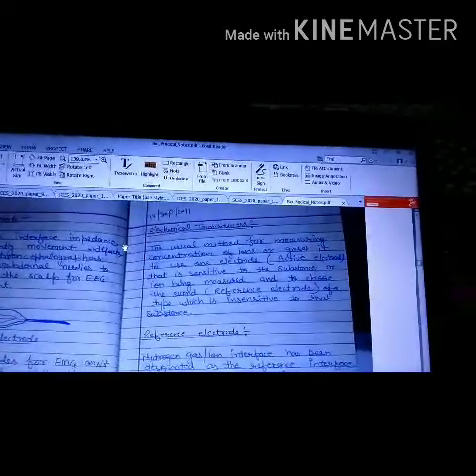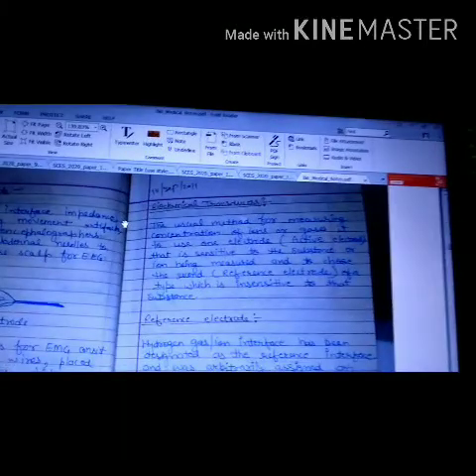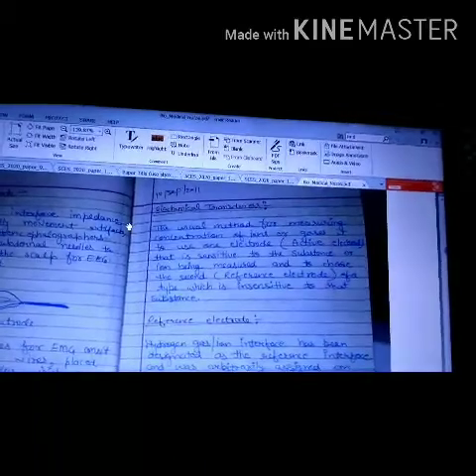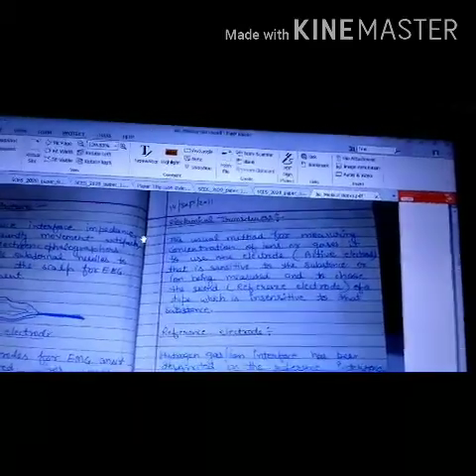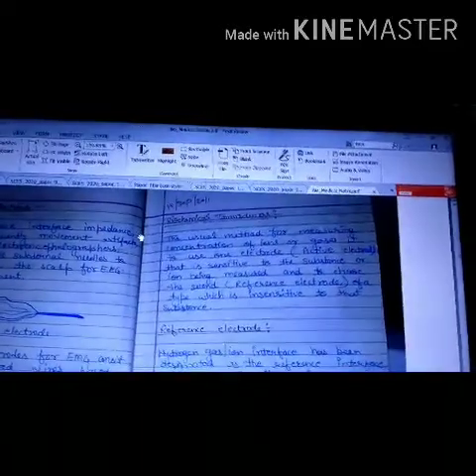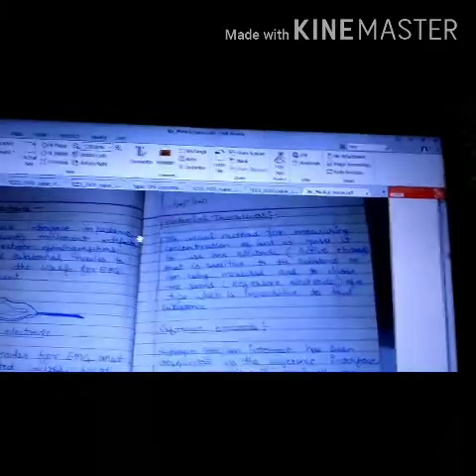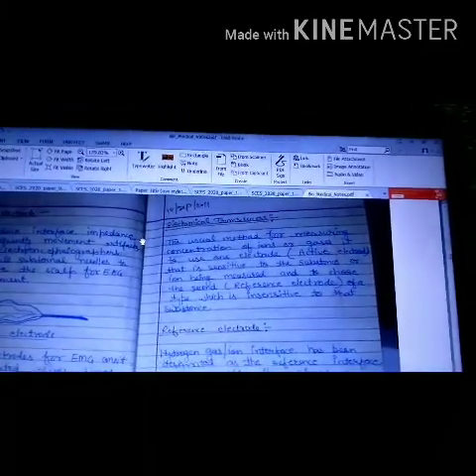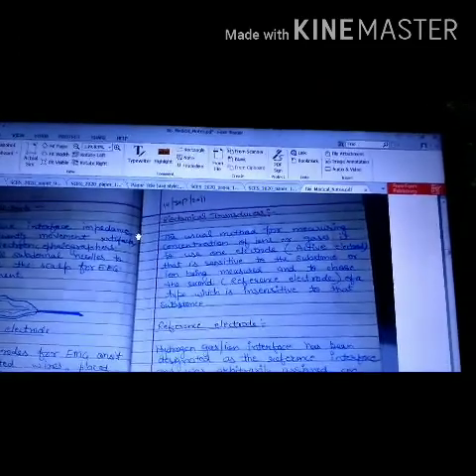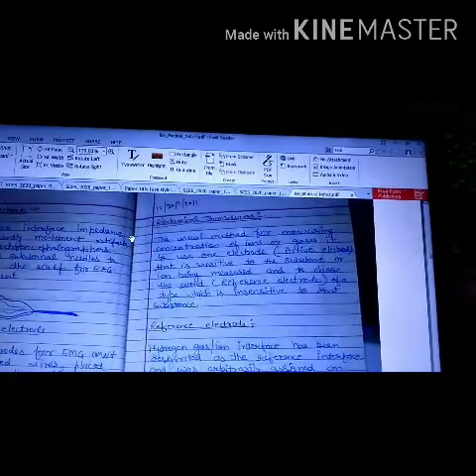The normal method for measuring the concentration of ions or gas is to use one electrode, an active electrode, which is very sensitive to the gas we are measuring, and with the help of this active electrode we use a reference electrode. The reference electrode is a standard electrode which is insensitive to that particular substance.